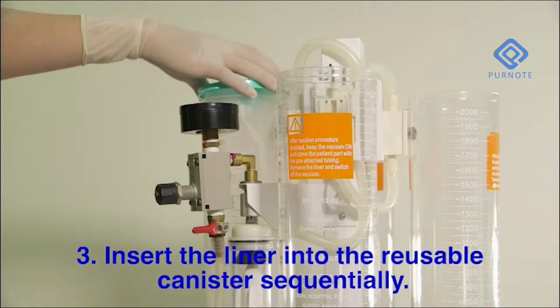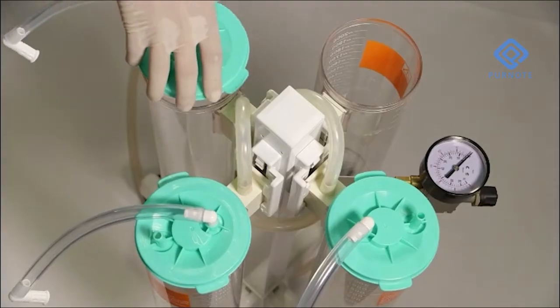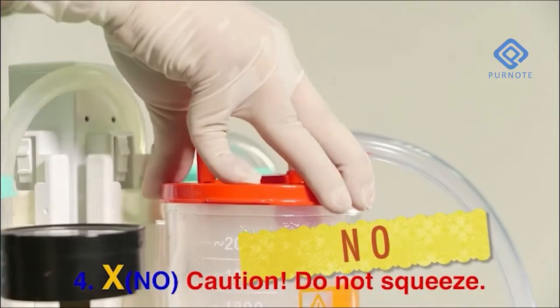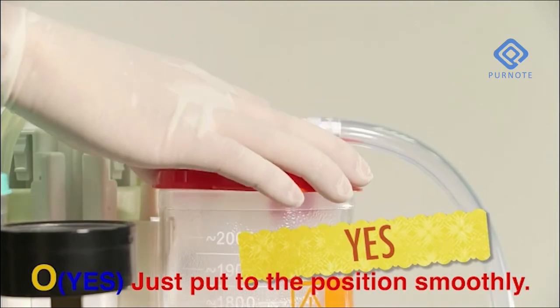Insert the liner into the reusable canister squarely. Do not squeeze. Just put it to the position smoothly.